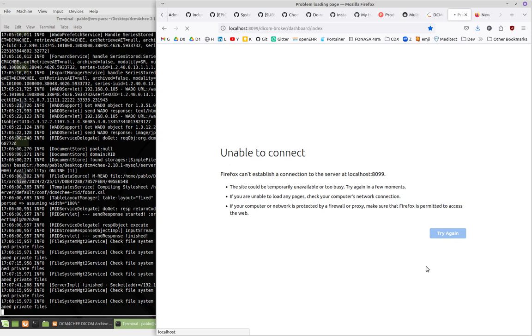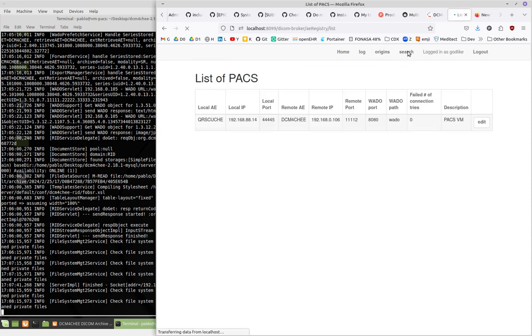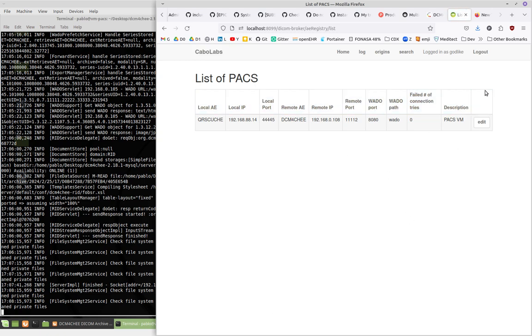So it's a dumb application really. So yeah, login, origin, let's see if it didn't change. Yeah, it changed. So it's kind of deleting the states each time I'm running the application, because the application might be in development mode. That is why it's deleting everything.